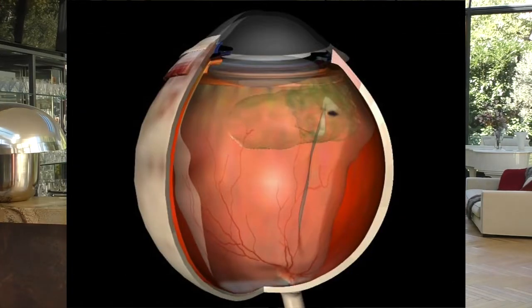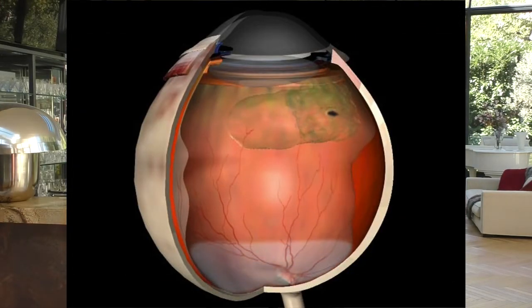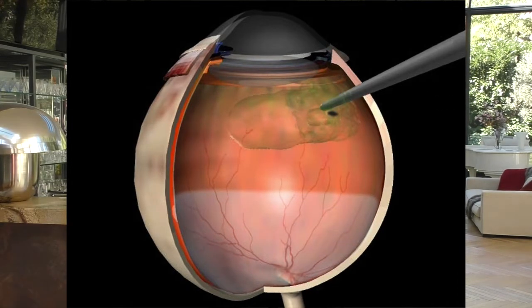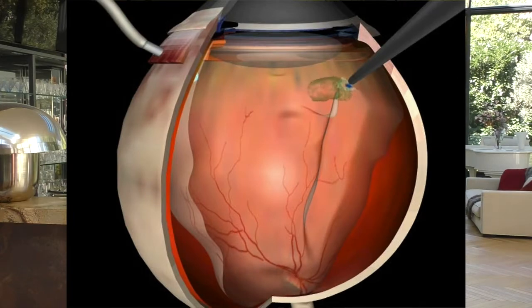It is then necessary to stop everything to treat this complication before things get worse, either by extricating the retina by exchange or perfluorocarbon injection techniques, or in case of failure by a retinectomy limited to the incarceration.